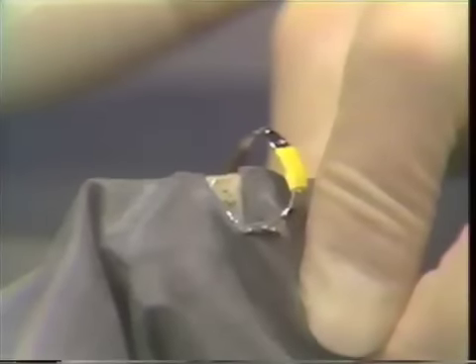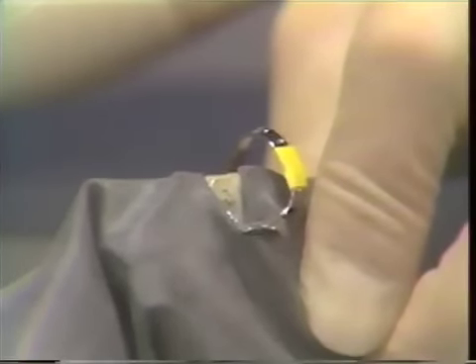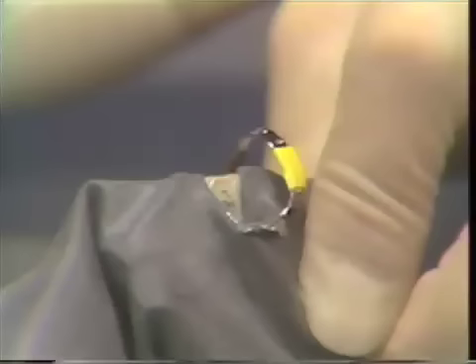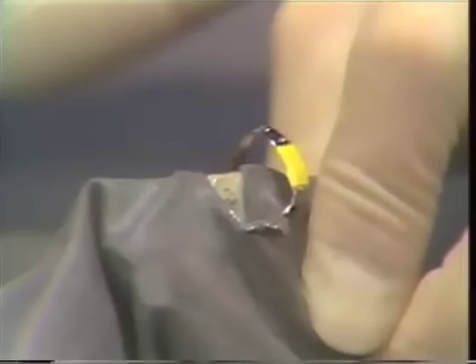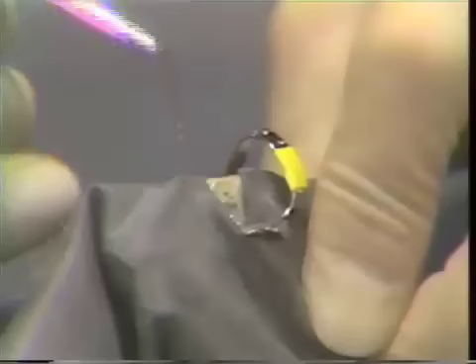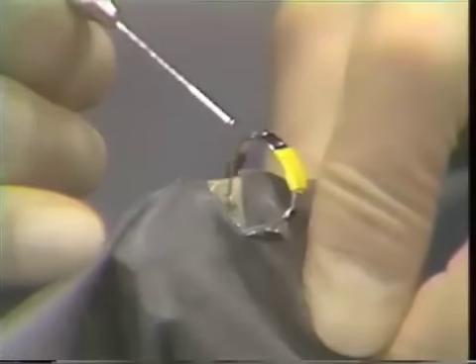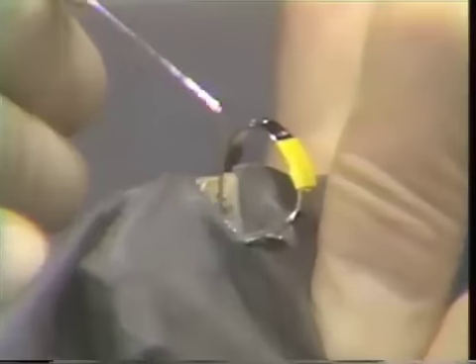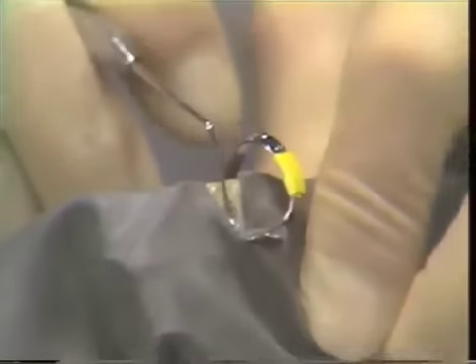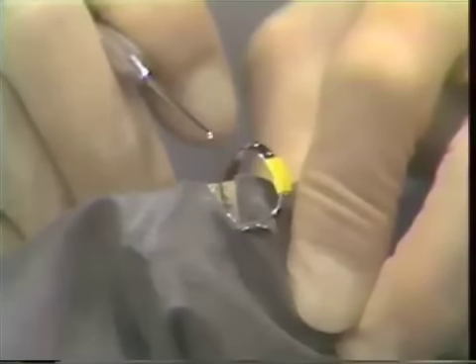Mandibular anterior and bicuspid teeth are similar in that they usually have one canal leading directly off of the pulp chamber. However, both mandibular anterior and bicuspid teeth have a tendency to have two canals, and you have to check each tooth to make sure that it does have only one canal. You do this by coming in at different angles and looking for a second canal — come in heading towards the labial and have it geared right down into the pulp canal, then come in from the lingual and go right on down. Feel for two canals, and only accept that you have one when you're sure that you can't feel a second.